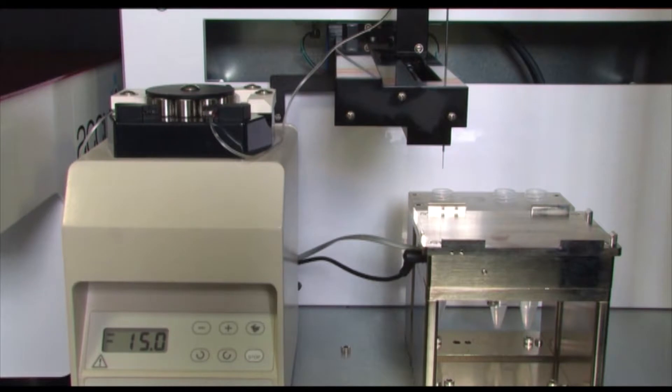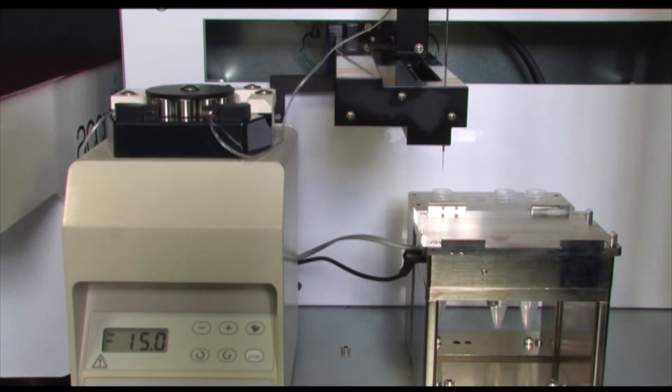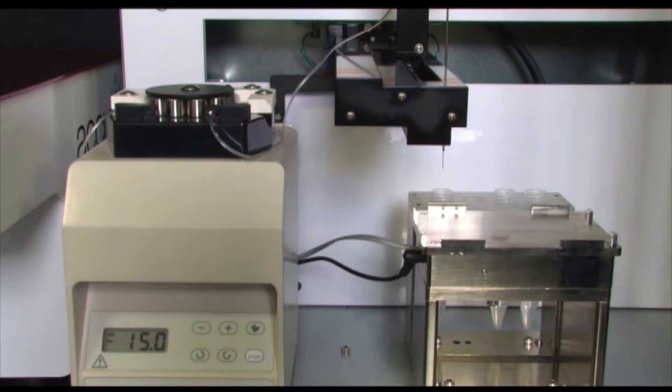While the first plate is being washed, the flow cytometer is primed. The cytometer used in the Sirocco is the C6, which has been developed by Accurie cytometers of Ann Arbor, Michigan. Accurie is now owned by Beckton Dickinson.